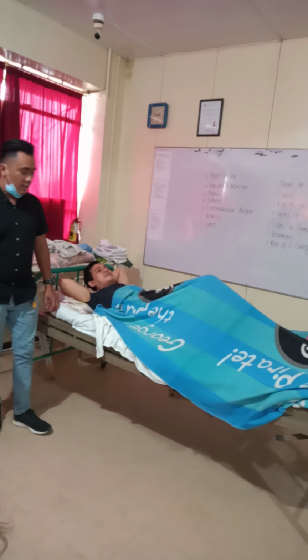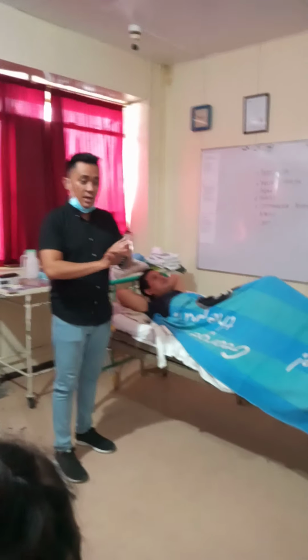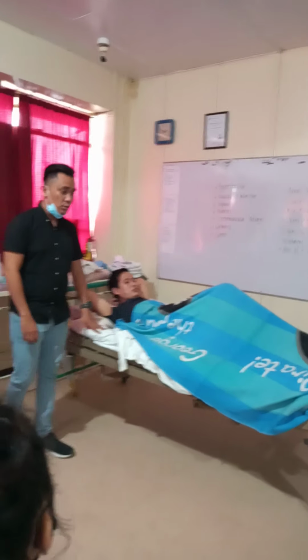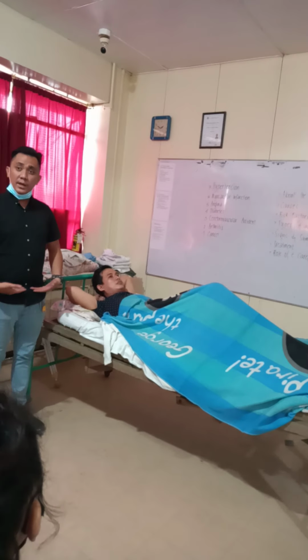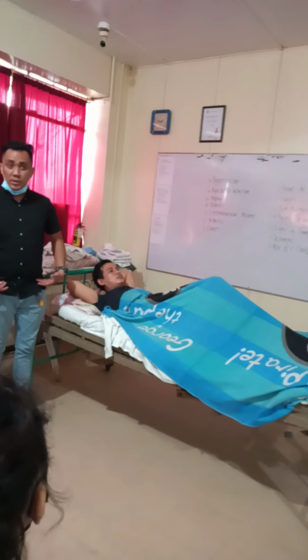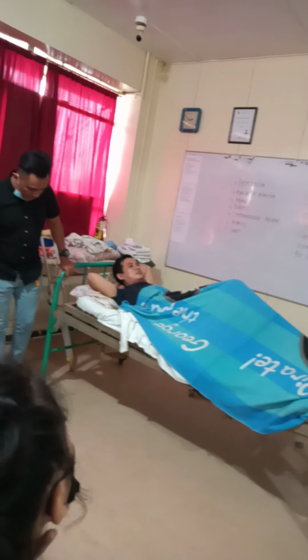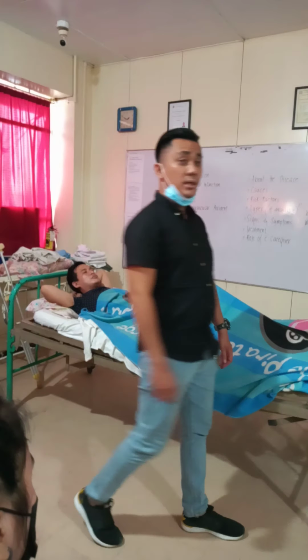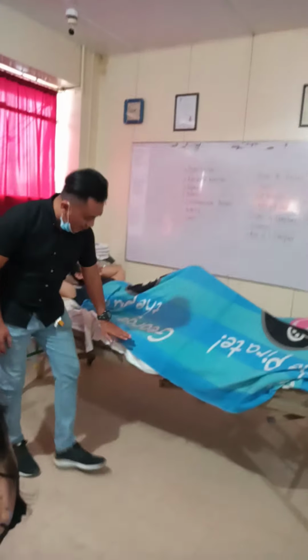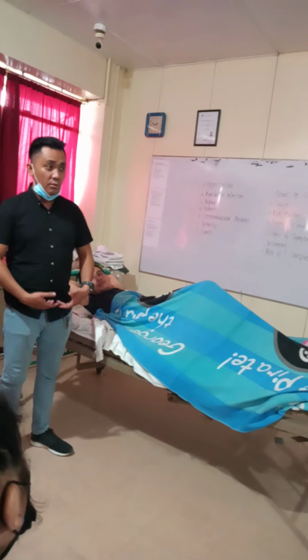Okay, now after providing privacy, do hand washing. After doing hand washing, then you have to prepare the bed. For the bed, it should be at least level with the hips of the patient. Then all side rails should be locked and all wheels of the bed should be locked. So again, the level of the bed should be at least at your hip level for good body mechanics.